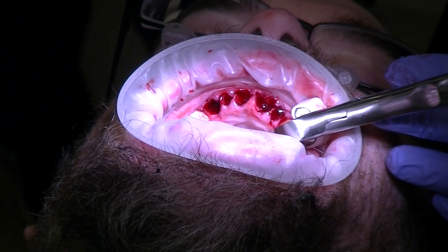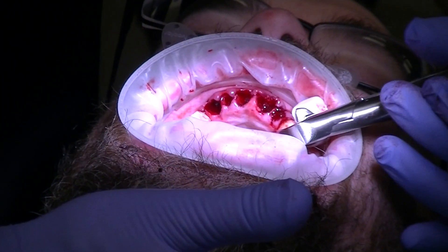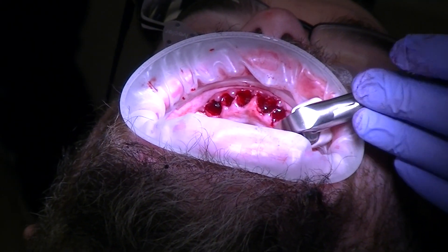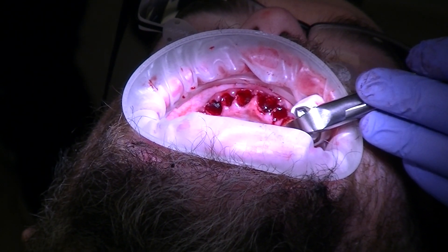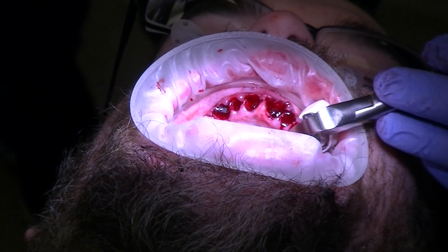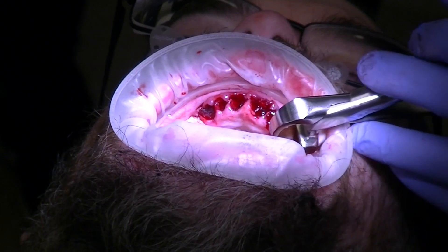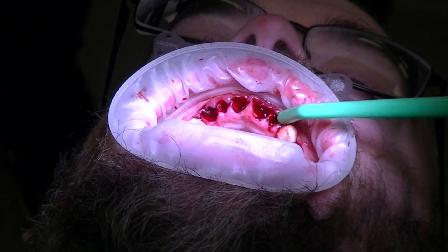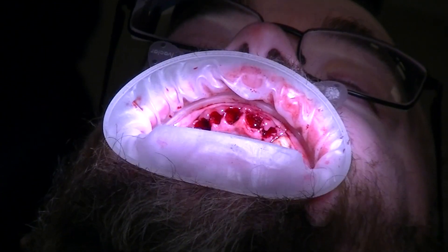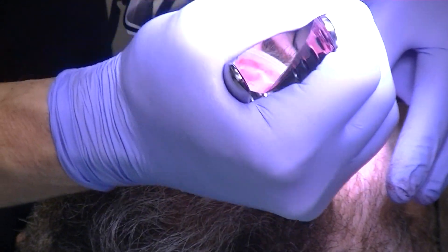Going in this direction you may not know, and this is an awkward movement to do with your wrist. Not squeezing hard, just going toward the long axis. Kevin mentioned his first experiences with extractions before us were not very good, but if you look at his expressions it doesn't look like he's feeling anything but pressure. Would you agree Kevin? Yes, so far so good.